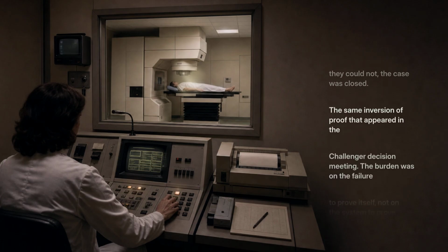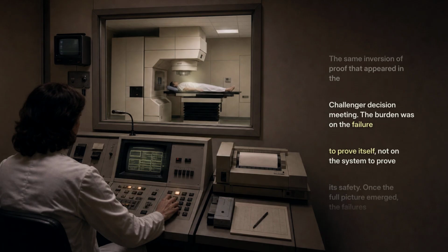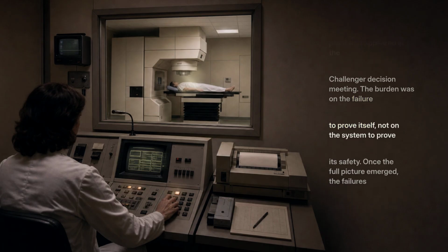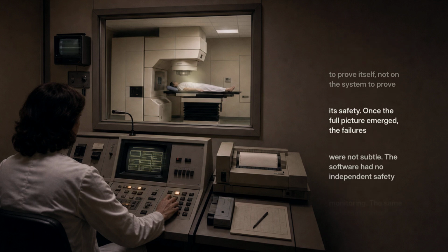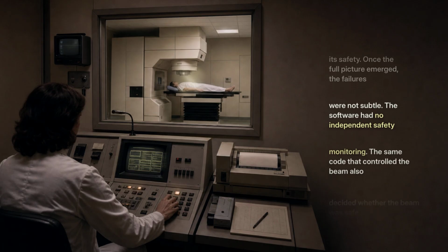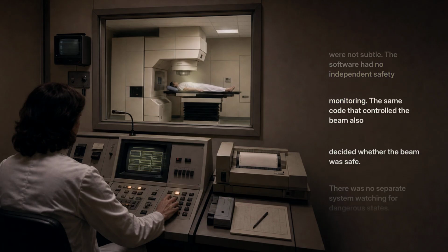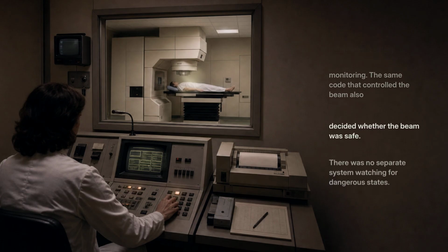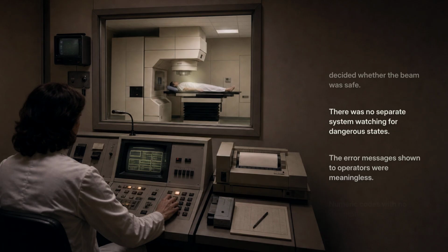The same inversion of proof that appeared in the Challenger decision meeting. The burden was on the failure to prove itself, not on the system to prove its safety. Once the full picture emerged, the failures were not subtle. The software had no independent safety monitoring. The same code that controlled the beam also decided whether the beam was safe. There was no separate system watching for dangerous states.